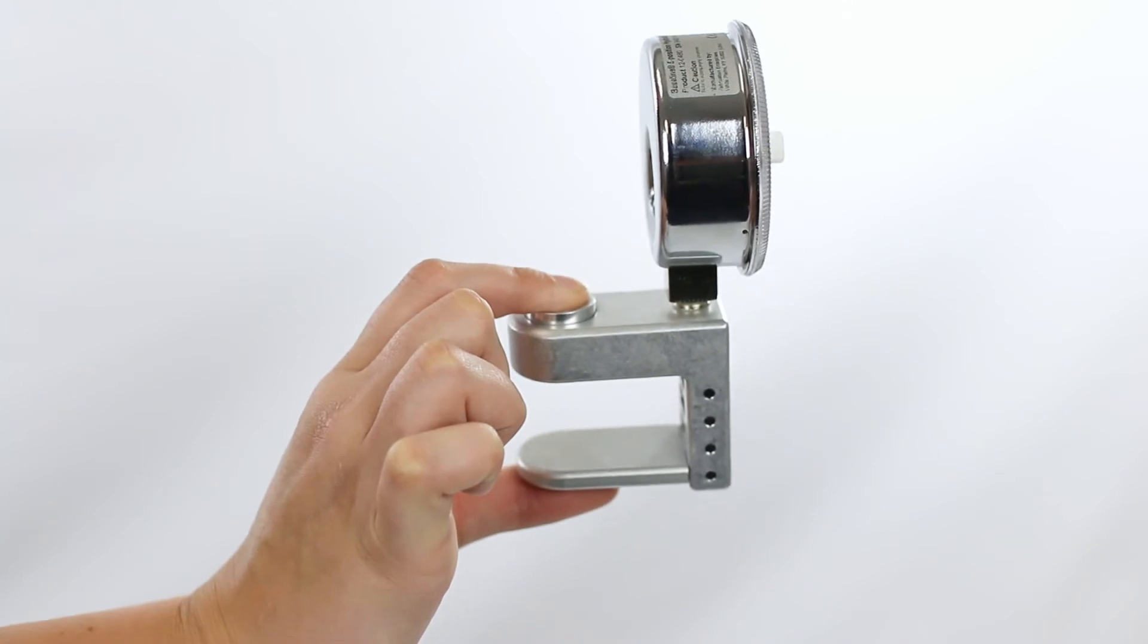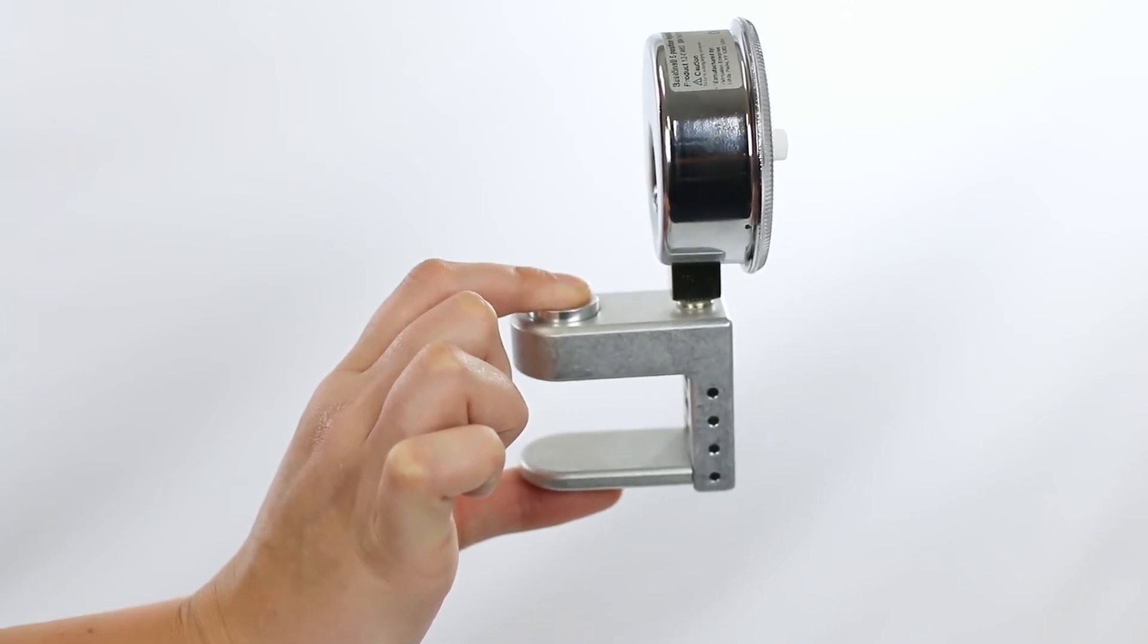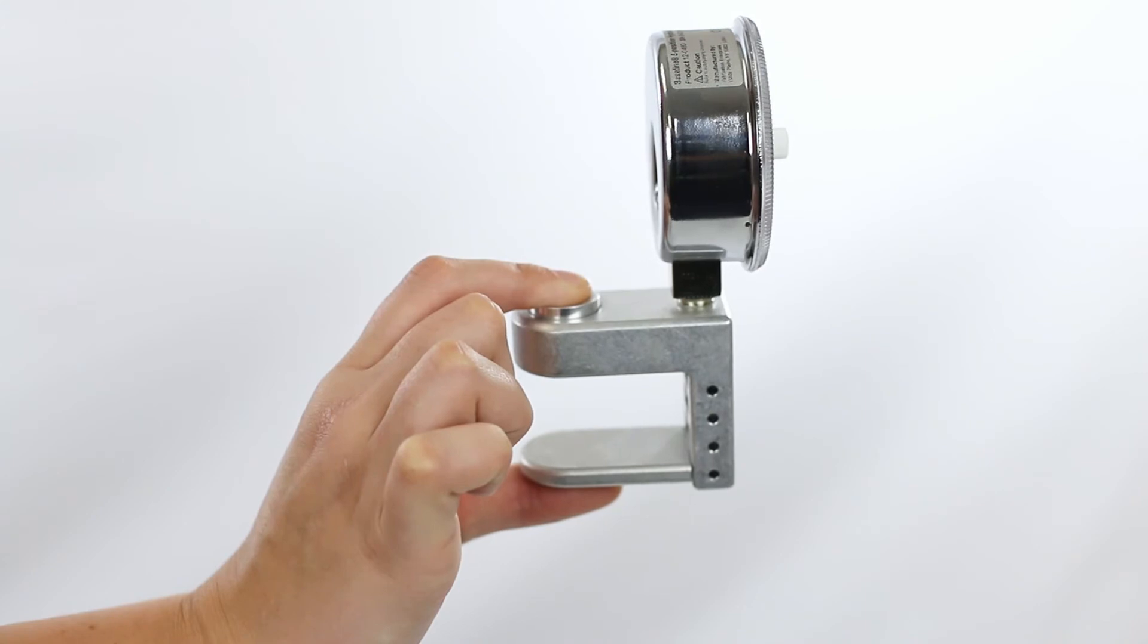For the tip test, the patient should have the test finger on the button. Have the patient pinch the gauge between the thumb and the test finger.